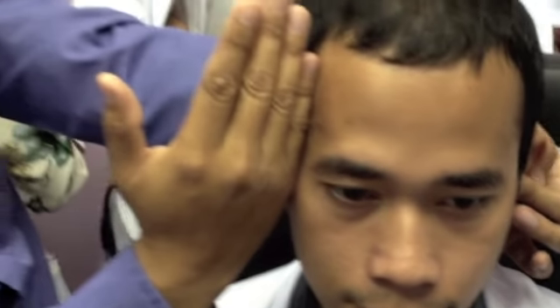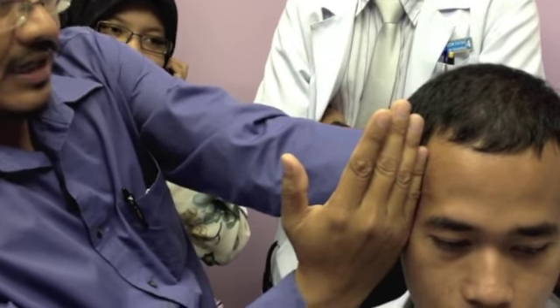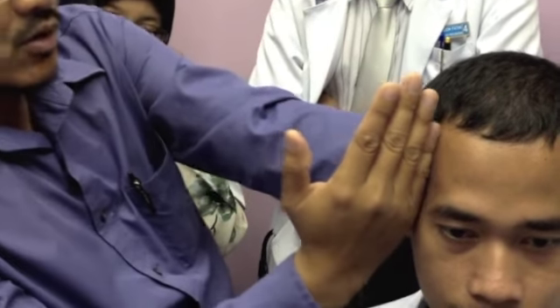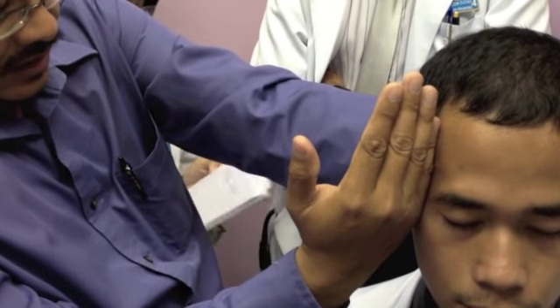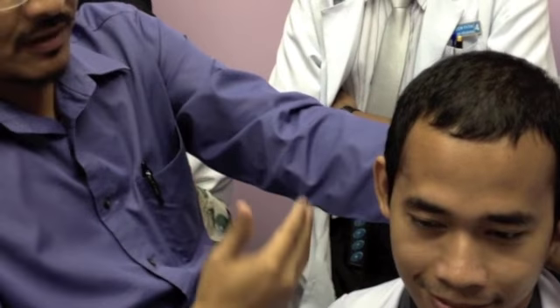You cakap 75A. Ulang. 75A. 38C, 38C. 28A, sebanyak 5 kali. Conversation level first. Then you go whisper. Dia boleh dengar semua kan? 73A. 73A. You janganlah whisper.